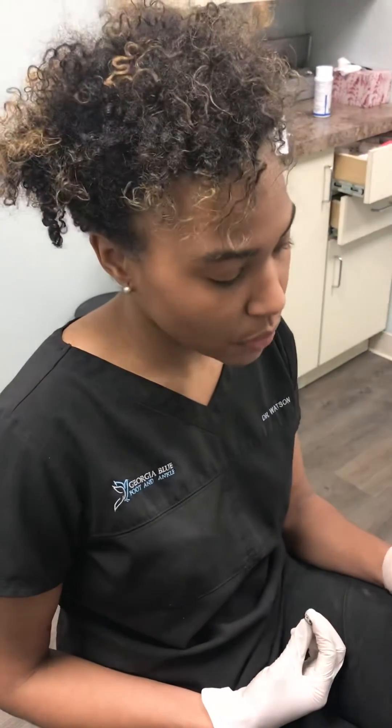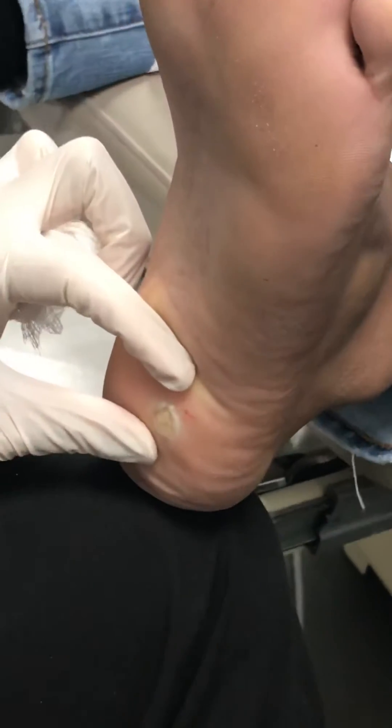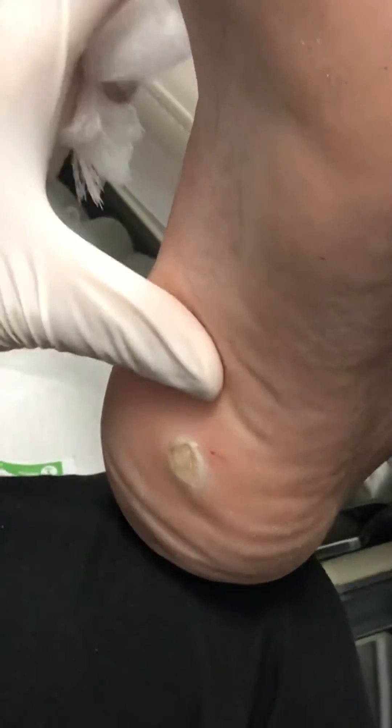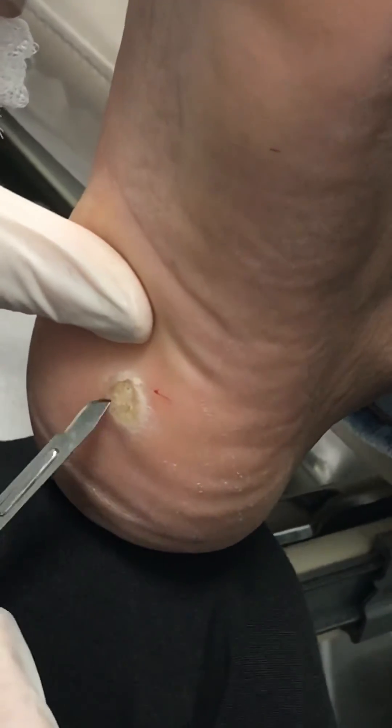Hi, this is Dr. Watson with Georgia Blue Foot and Ankle. Today we have a wart I want you guys to take a look at on the bottom of my patient's foot. He's 16 years old. As you can see, the skin lines are interrupted and it has its own little black vessels. If you come closer you can see it.